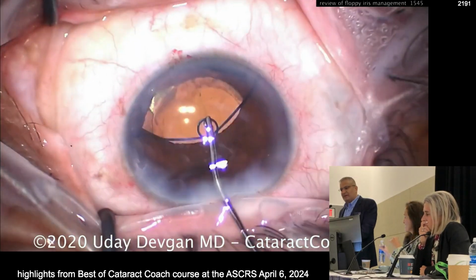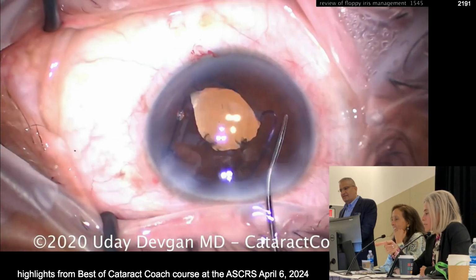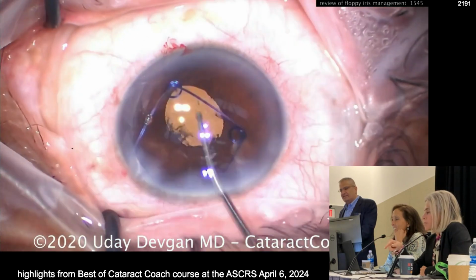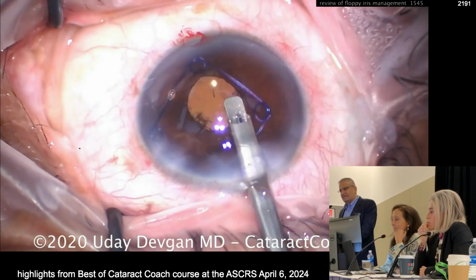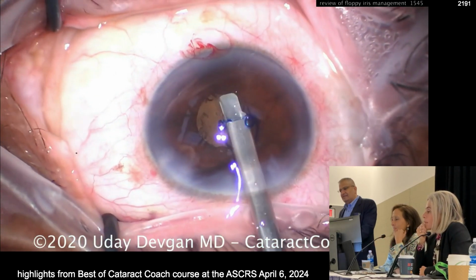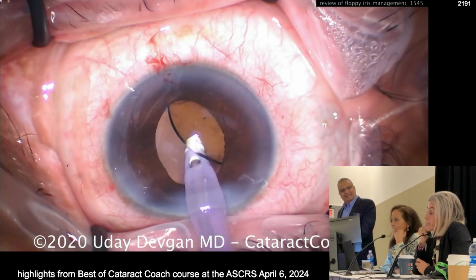Yeah, just full thickness paired incisions. I just take off the proximal one, remove it and then reinsert, and then everything else is controlled and comes in. Oh, you do it that way. And I just grab it anywhere and just get rid of it. Was that okay? That was very innovative.